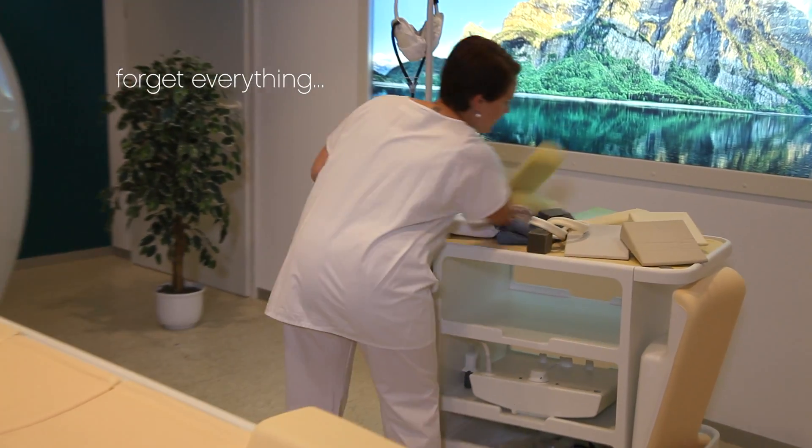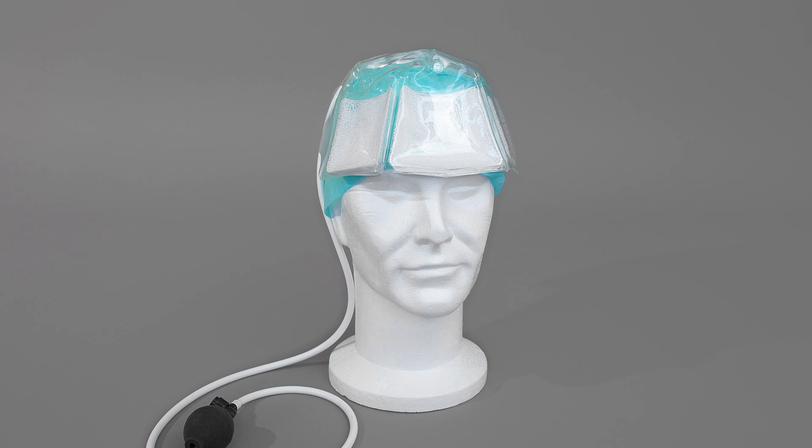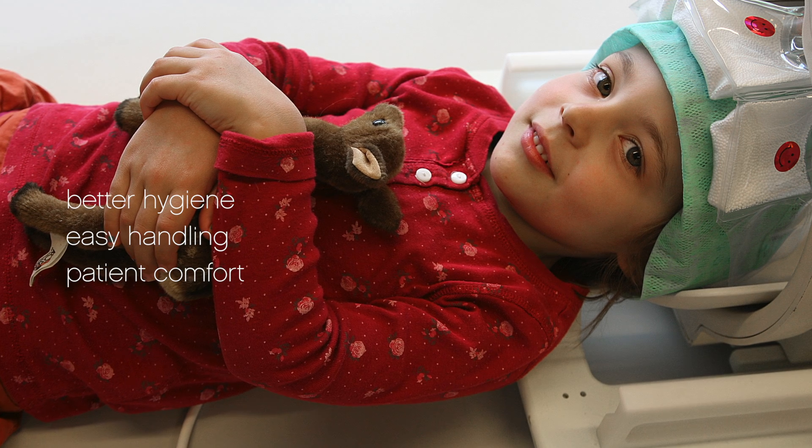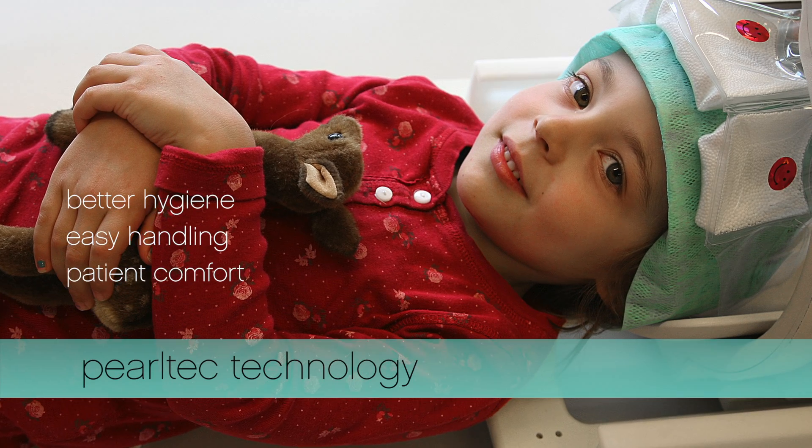Forget everything, and take a look at the new PearlTech product family that offers you a tool that solves everything. Better hygiene, easy handling, and increased patient comfort are combined in this head positioning product.